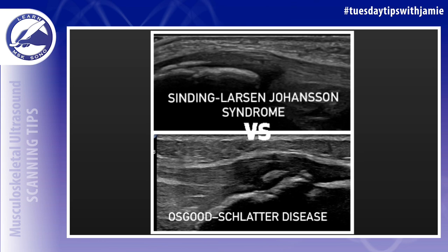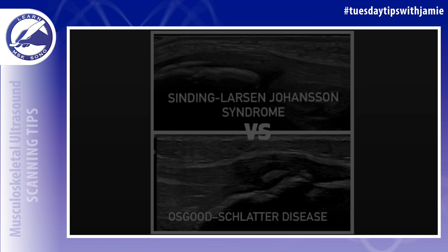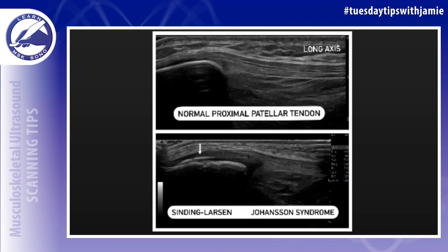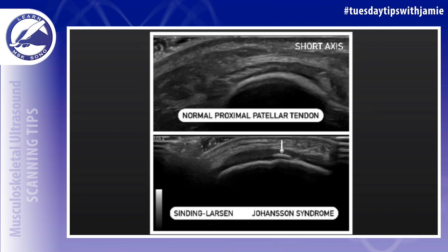They can be differentiated from each other on ultrasound by visualization of bone ossifications at the site where their symptoms are occurring. Here is a side-by-side comparison of a normal proximal patellar tendon compared to one with Sindig-Larsen-Johanssen syndrome in the long and the short axis.